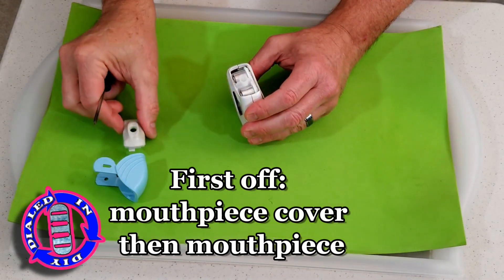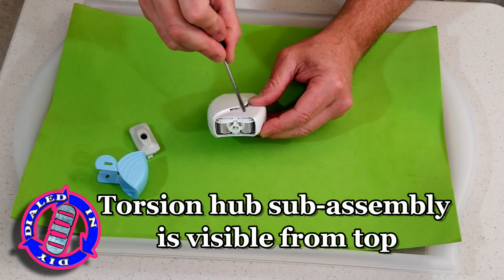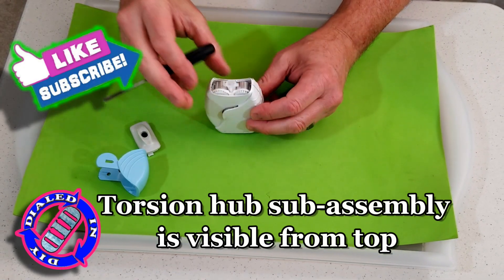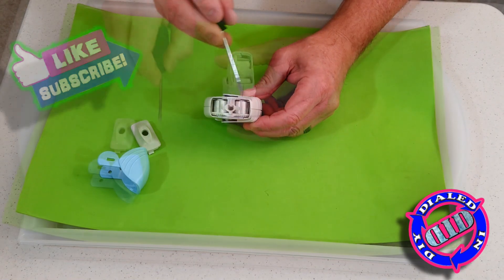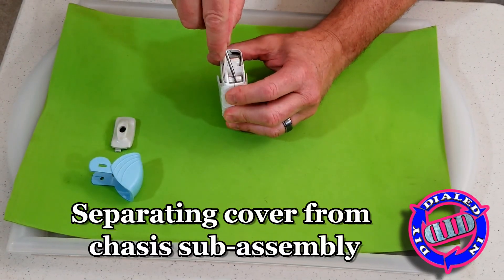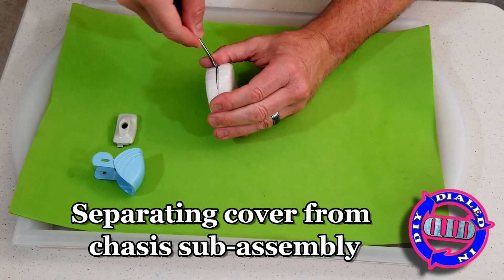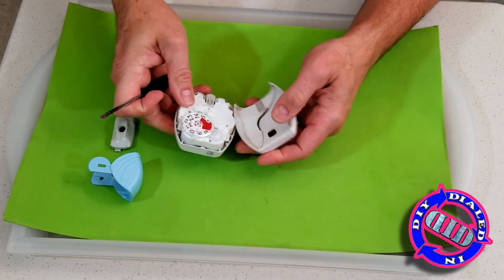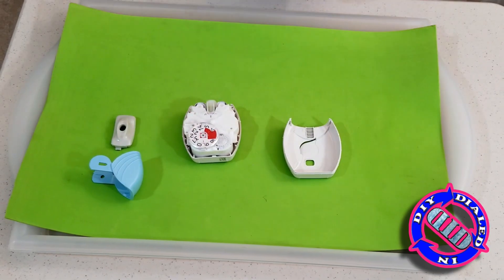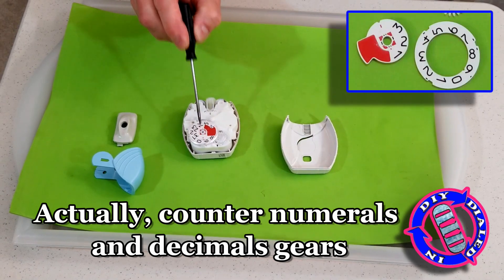As soon as you get the mouthpiece out of the way you can see some gears as well as some shiny metal tape that's coiling up, which has me very curious about how the mechanisms inside work. So of course we're gonna keep ripping the thing apart. These come apart with nothing other than just a little bit of extra brute force. Hey, check it out — it's actually a dial in a Dialed In DIY video!